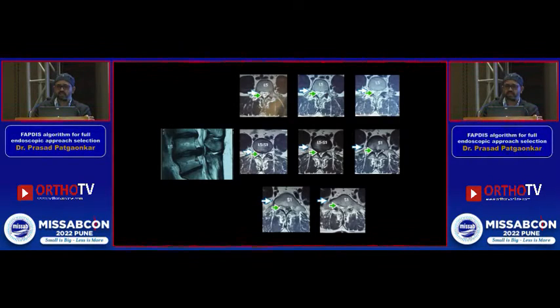So how do we see? We need to see all those cuts at the upper discal level, lower discal level, middle of the disc, middle of the vertebral body, so that we don't miss any sequestrated herniation, superiorly or inferiorly migrated, and middle of the pedicle. If we see all these cuts properly, we come to a proper conclusion that this is the offending pathology which needs to be removed.